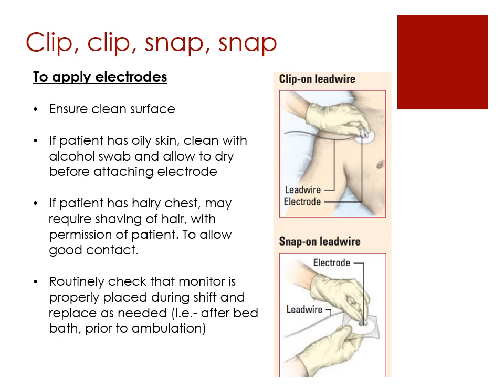Make sure that when you're putting it on the surfaces, especially if you have people who are really sweaty, please wipe the area dry first. They used to clean with alcohol swabs, so that it allowed the skin to really dry. You won't see that as much anymore. They really just wipe to make sure it's a dry skin area, and then they'll attach those electrodes on there.